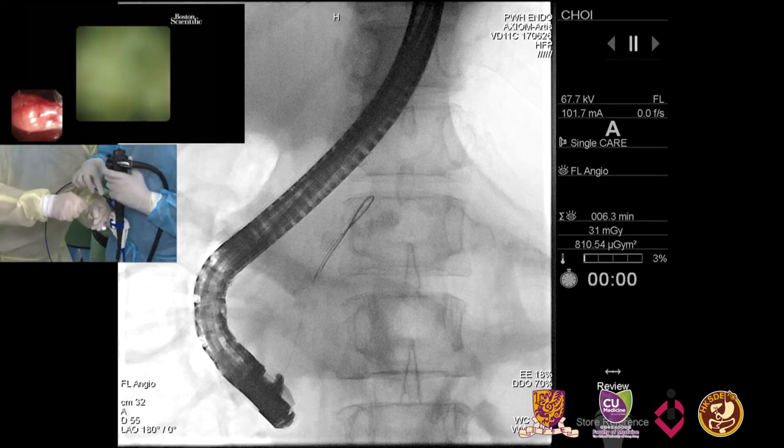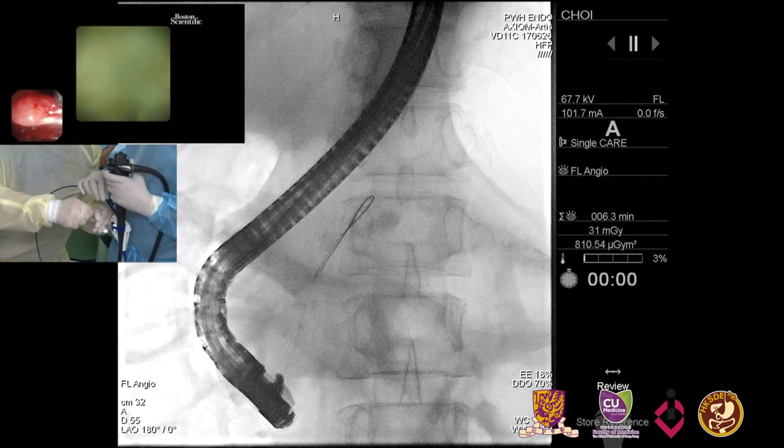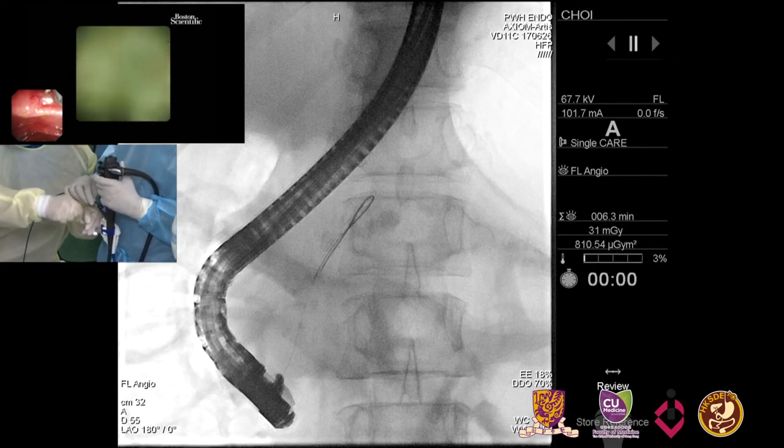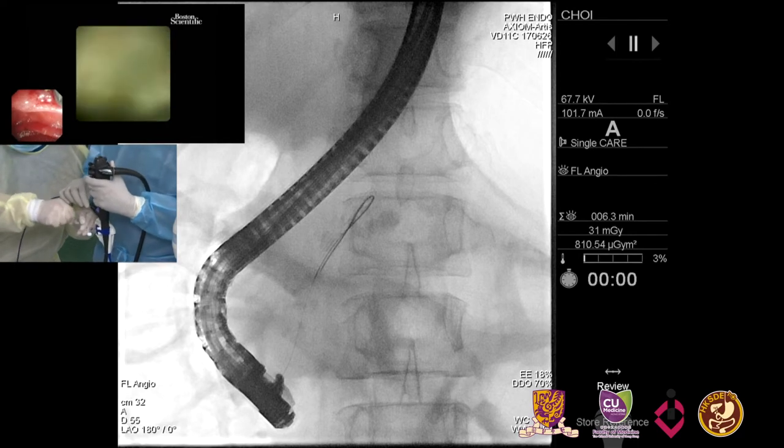Sometimes in the bile duct, if you have a huge bile duct and a lot of stone burden and you're trying to clear it, it could be helpful under direct visualization. There's also a small snare. The problem is probably the channel; in the third version they may increase the channel. If it increases, passing these accessories will become easier. Otherwise, it's not so easy sometimes to pass.